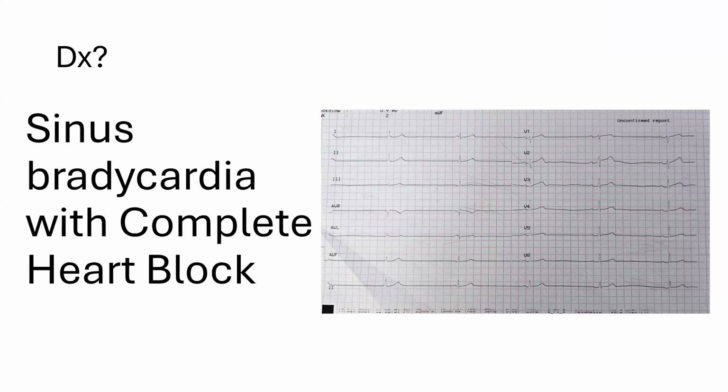I will disagree. When we talk about sinus bradycardia, we usually mean that the sinus node is driving the heart. But when the sinus is on its own and the ventricle is on its own, we do not talk like that. We could say the sinus beat is at a lower rate, and there is a junctional escape rhythm because the complex is narrow with a heart rate of so and so. But we could not say complete heart block with sinus bradycardia. That's actually not the norm.